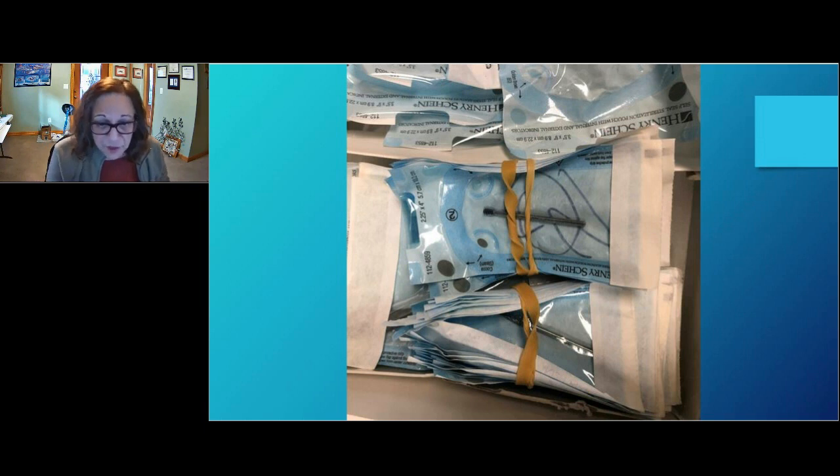I realized that this practice was trying to keep the dental burrs together in a usable manner, which is understandable, but there are commercial alternatives to rubber bands. There are some manufacturers that make a ribbon, so to speak, that is cleanable, washable, and reusable, that you can put around your packages that won't put that kind of pressure on it.